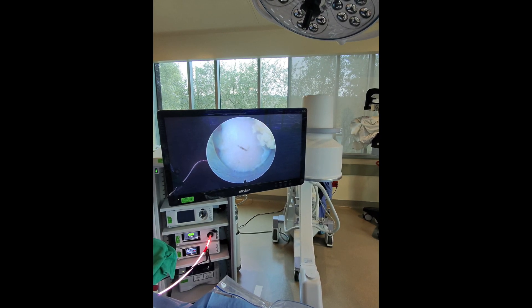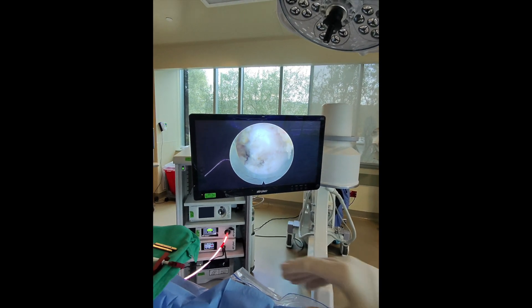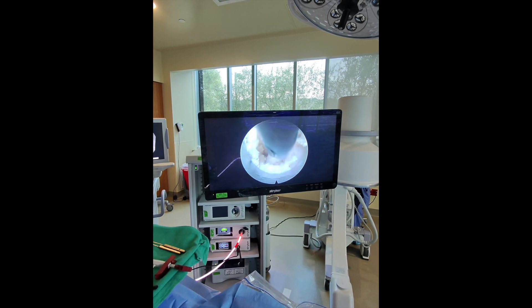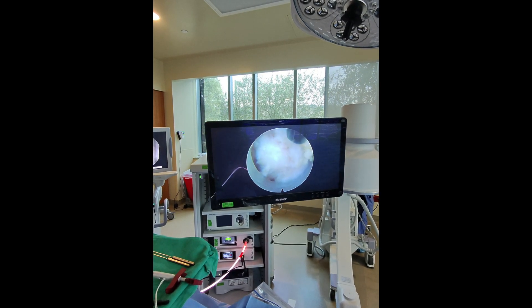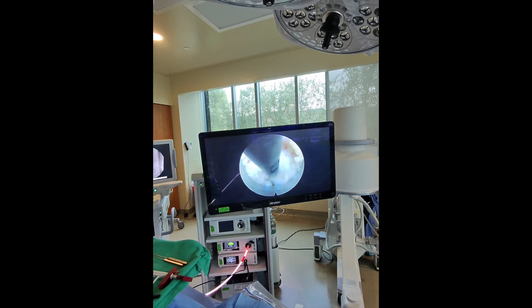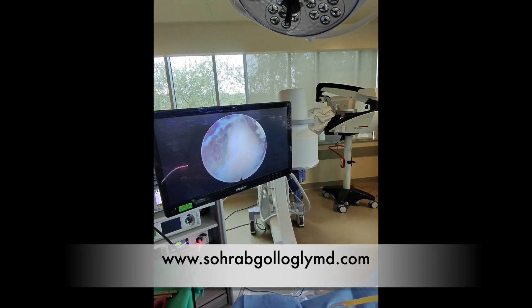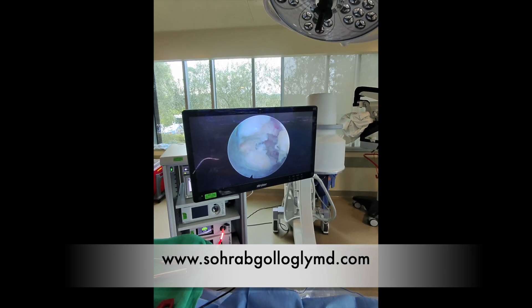With our hands in the vertical position we are at the cranial limit of the drilling required to remove the ligamentum flavum, and then as we wand our hands toward the patient's feet we can both palpate and visualize the inferior lamina with the grasper. Here's the inferior lamina — I'm tapping on the bone — this is the condensation of fibers going from the ligamentum flavum into the facet joint, this is the lateral recess, and here is the leading edge of the lamina coming around to the junction between the lamina and the spinous process. The interspinous ligament is just up here. Now we're ready to start drilling. After the initial drilling we can now visualize the ligamentum flavum, the midline raphé in the center, and the contribution of the spinous process and interspinous ligament from above.